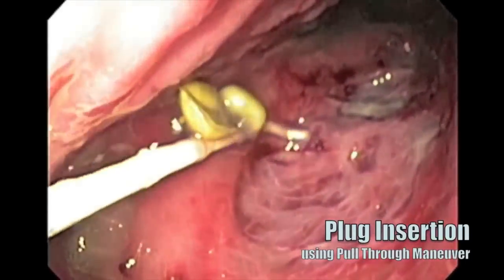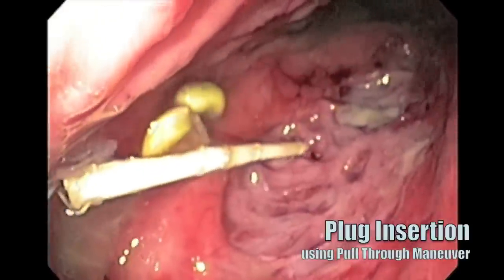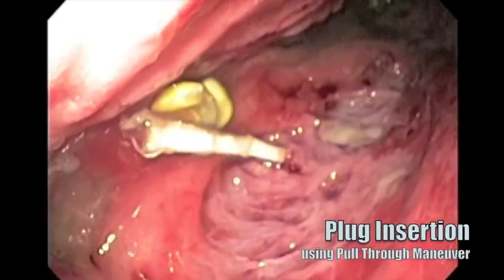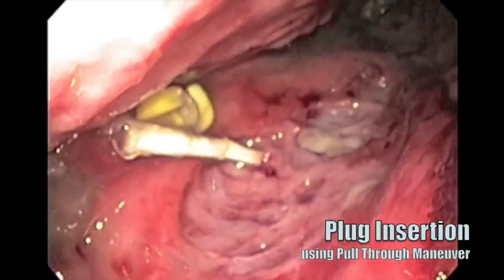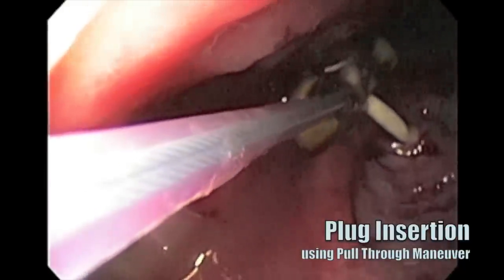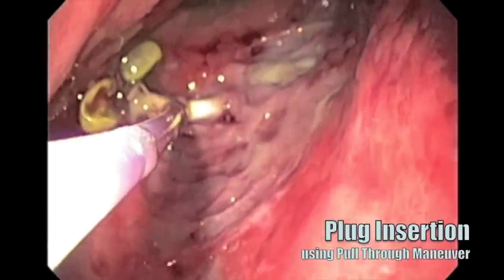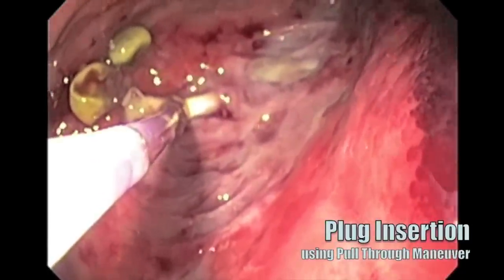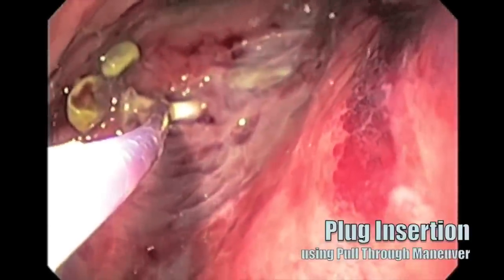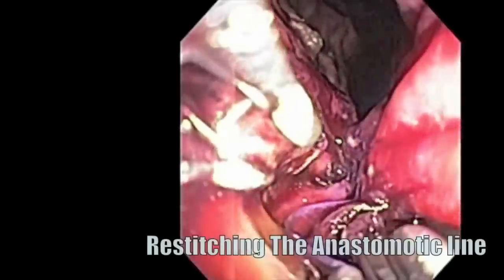The fistula plug is secured into the delivery sheath, then pulled retrograde through the mouth until the plug is inserted into the fistula. Finally, using the pull-through maneuver and with the help of the snare, the plug is secured in place. Once multiple fistulas were closed with fistula plugs, the overstitch system was used to reinforce the staple line.